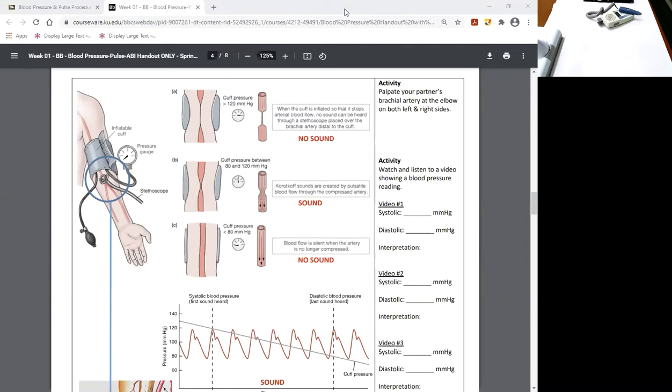When you do this technique, you're going to report to the patient both of those pressures. You're going to say your systolic pressure was this, your diastolic pressure was that, okay? So with that in mind, instead of using a stethoscope, we're going to use a Doppler ultrasound here in a second. And Judy's going to show you how you can determine systolic pressure, not the diastolic, but specifically the systolic. And you all should hopefully be able to hear it and see it with the pressure gauge. So with that, let me mask up here and switch.